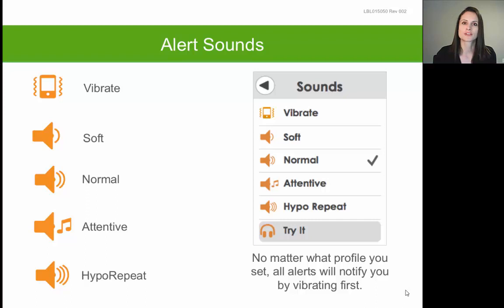The next sound option is Soft, which is one of the quieter or more discreet tones. After that is Normal, which is a little bit louder, and then Attentive, which is the loudest sound available. The last option is Hypo Repeat, which is a similar tone to Normal, except if your glucose hits the urgent low of 55, you will get an alert every five seconds as opposed to every five minutes until you clear or silence it.